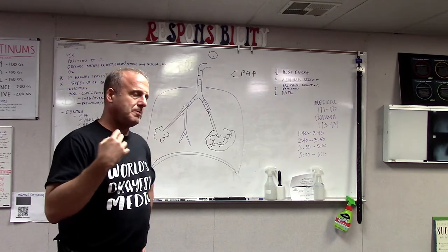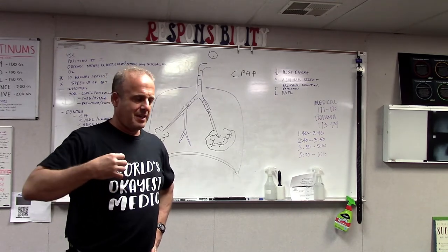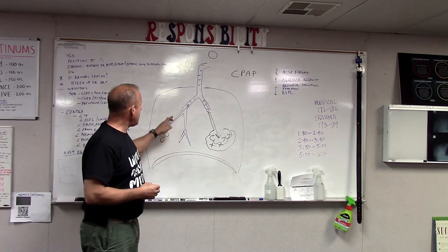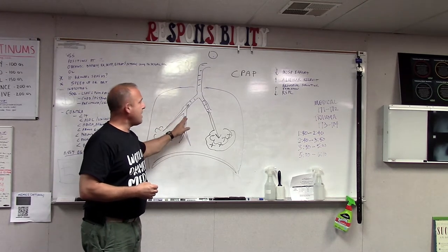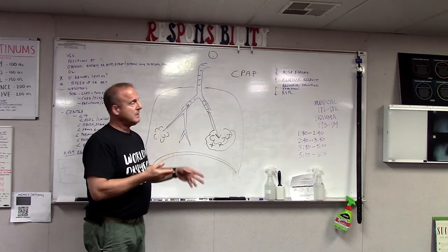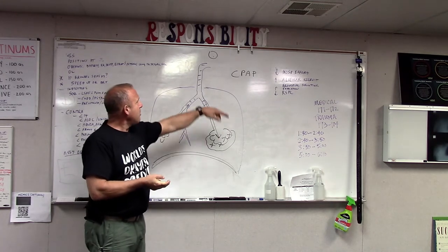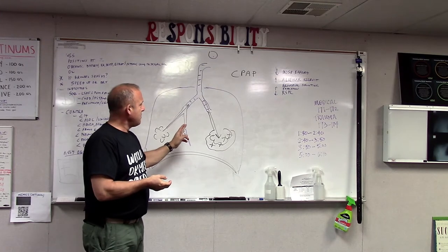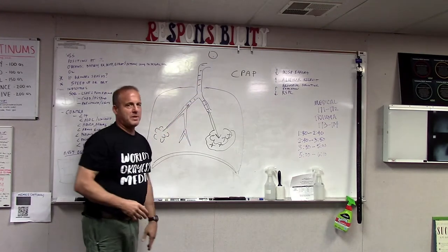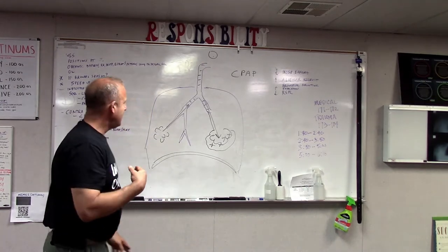In one way or another, in pneumonia to a lesser extent, but asthma to a significant extent, and anything that causes bronchospasm or bronchial hypersensitivity, where these guys collapse more easily for one reason or another, either due to lack of support because of the external framework, because they're narrower due to inflammation or hypersensitivity or fluid, collapse happens. CPAP helps resolve that, or at least improve it, by helping the effort on inspiration, but just as important, providing resistance during exhalation. So it creates that back pressure, which helps keep these guys open again. Can't wheeze with that little back pressure. Continuing on to the next one.